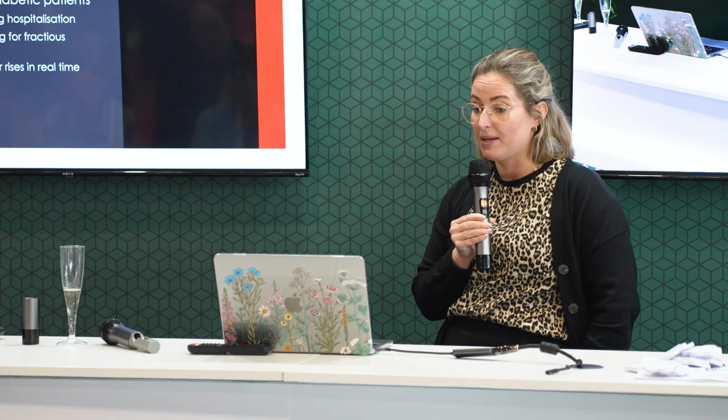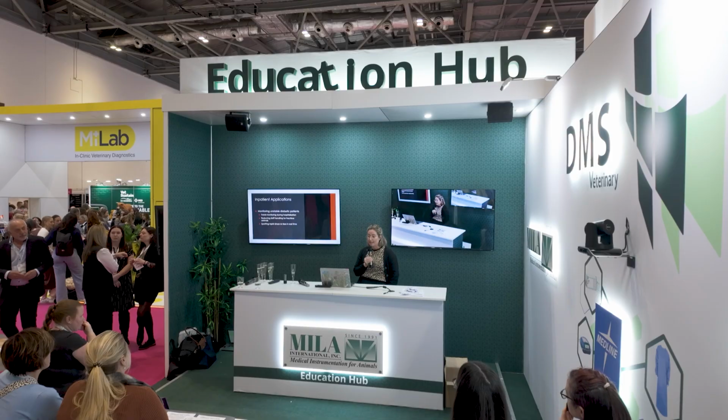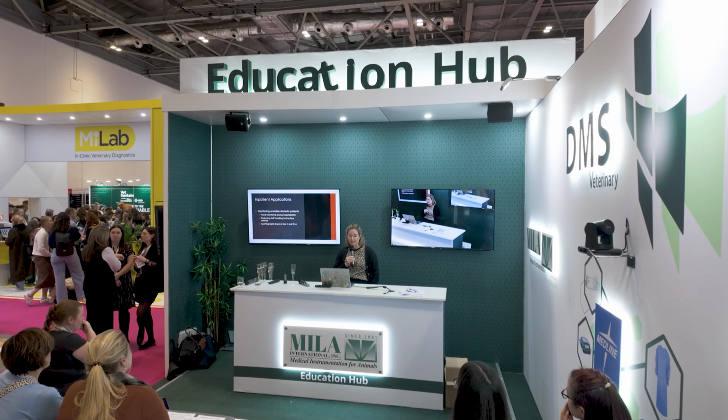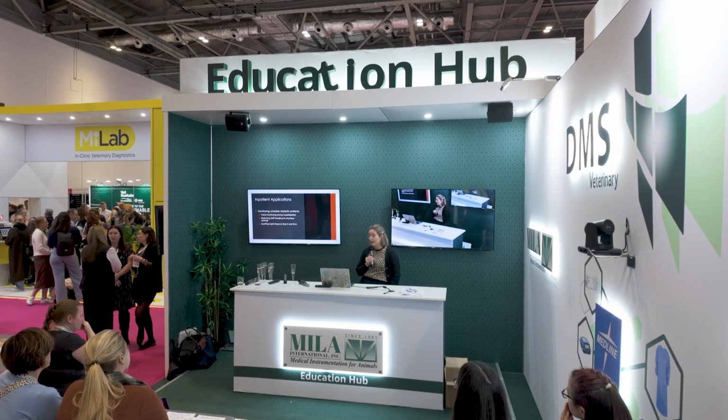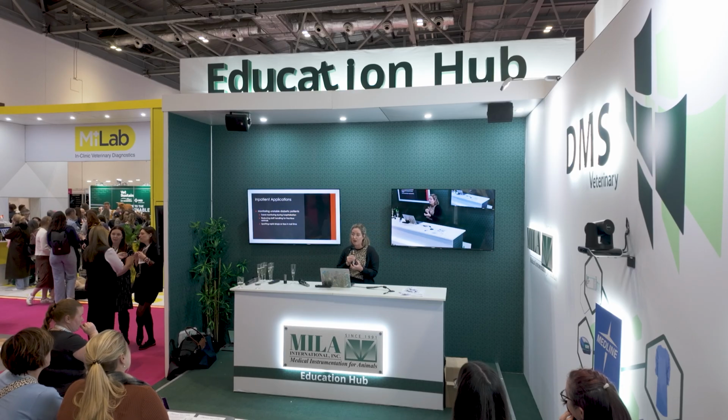And so this is where it's going to be very helpful in those patients which are unstable, or potentially if we have a patient with DKA. And again, it's going to allow us all those things that we've talked about in that hospital setting. And ultimately what we want to aim to do is reduce stress for that patient whilst they're with us in the clinic environment.